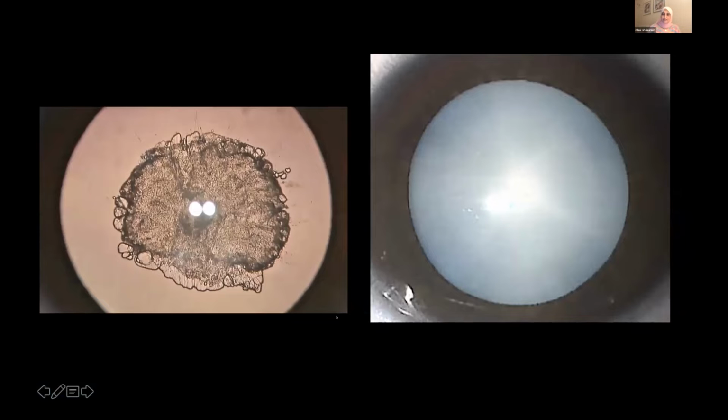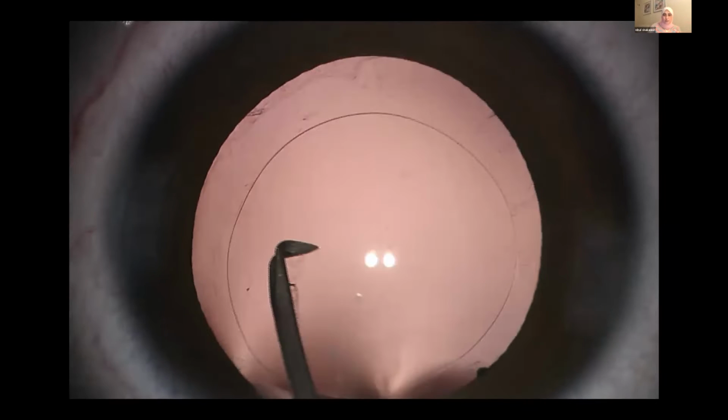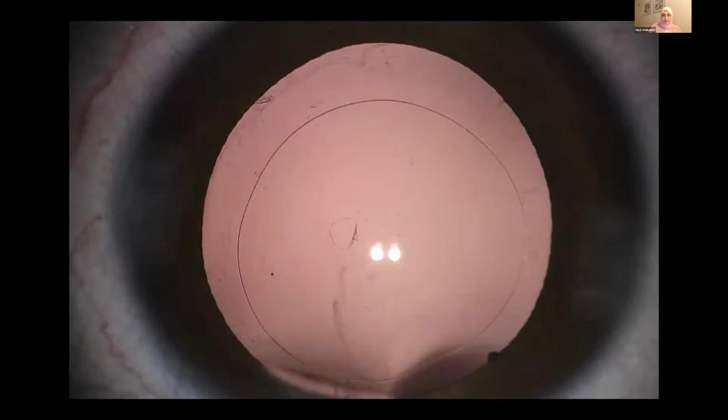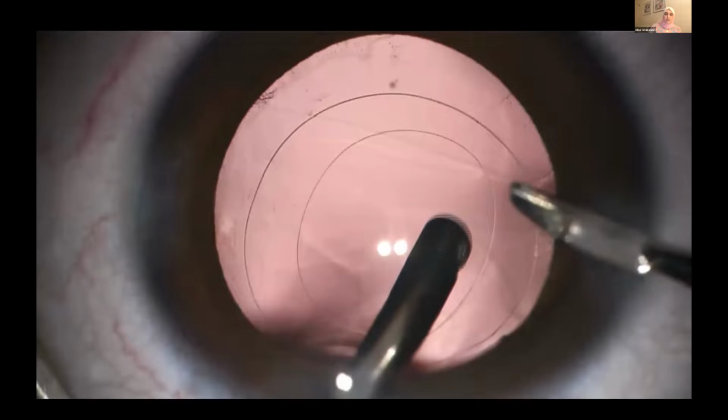I'm going to speak about traumatic cataract with defects in the anterior and posterior capsule. Not always is the traumatic cataract straightforward, where you have a transparent anterior capsule and perform a straightforward anterior capsulorhexis, and a beautiful posterior capsule where you go for hooking, tenting, and tearing into a triangular tear, injection of viscoelastic inside the Berger space, and then the straightforward posterior capsulorhexis we all know, simple because of the transparent posterior capsule, a 4 millimeter anterior vitrectomy, and then inject the IOL inside the capsular bag between the two rhexes.